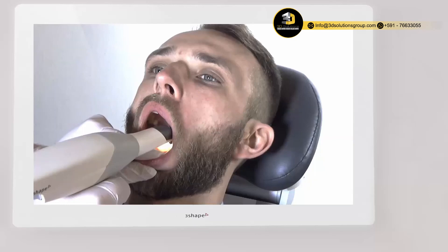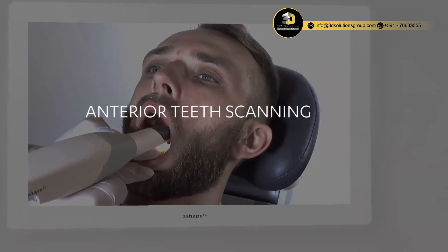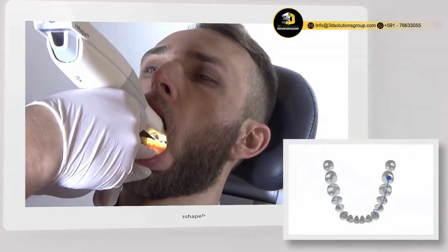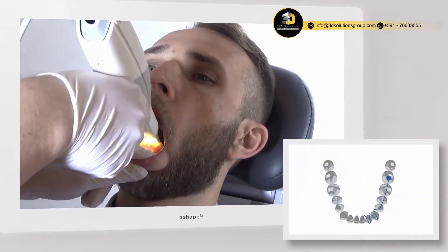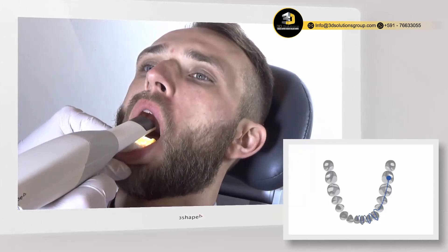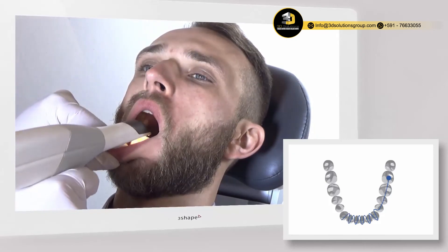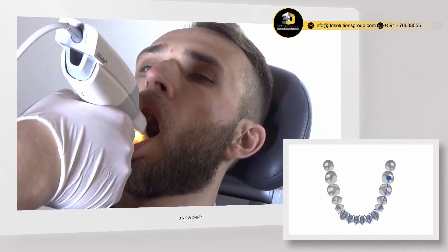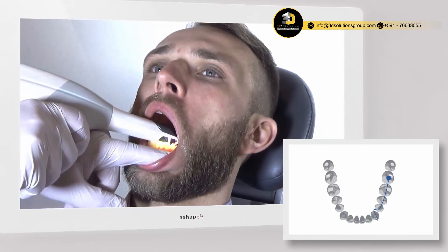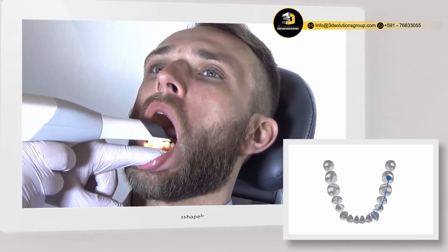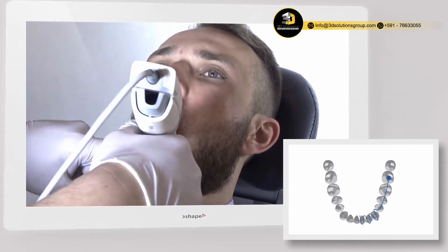Let's go over the important part regarding full arch scanning: the anterior teeth during the first occlusal swipe. You have to capture both the oral and labial side of each tooth, from canine to canine. The first strategy is to wiggle the scanner tip up and down over the incisal edge, making sure the software stitches over the edge on both sides. The second option is to wiggle over the anteriors by rolling the scanner tip while slowly moving forward.